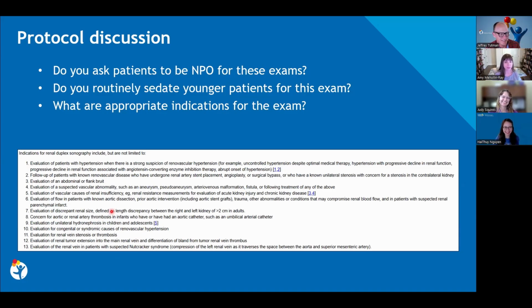And then the other thing is, with Doppler exams in general, they're always challenging from a time perspective. Our sonographers always try to minimize when they have to do Doppler. I have some discussion points on this later, but do you guys run into the ordering of unindicated renal Dopplers, and do you go along with it, or what's your approach or advice for handling those kinds of studies? So we, go actually, ahead.